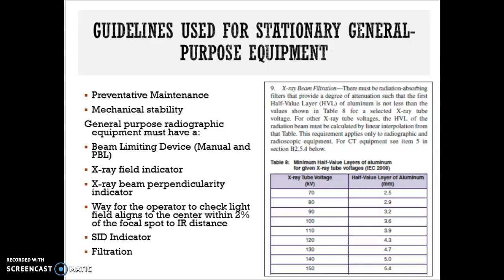Linearity tests are performed not only to monitor image quality, but to assess variation in output intensity that leads to unnecessary dose to the patient from repeat X-rays as a result of that poor quality or faulty equipment.